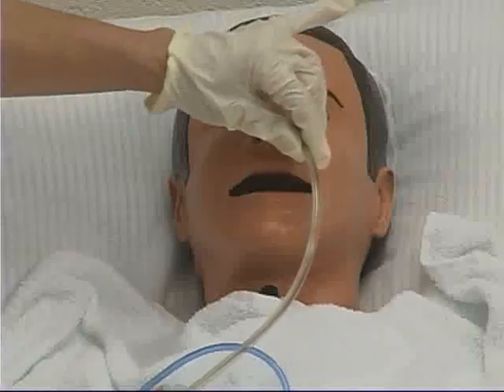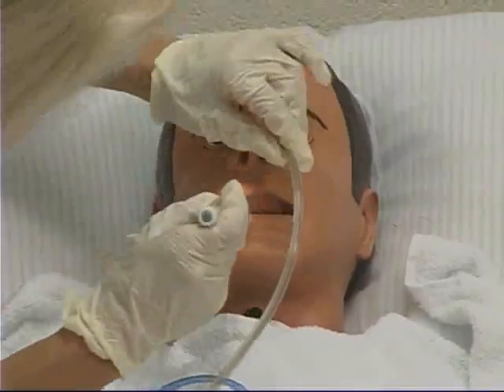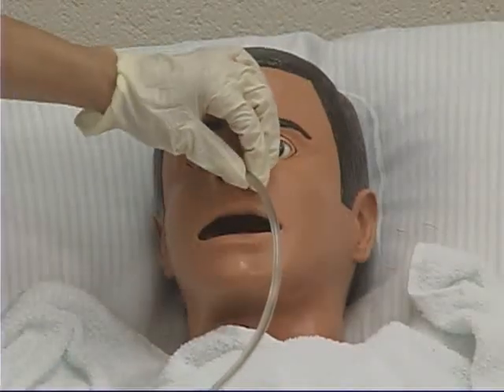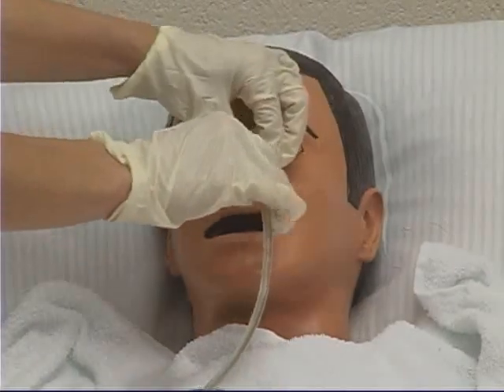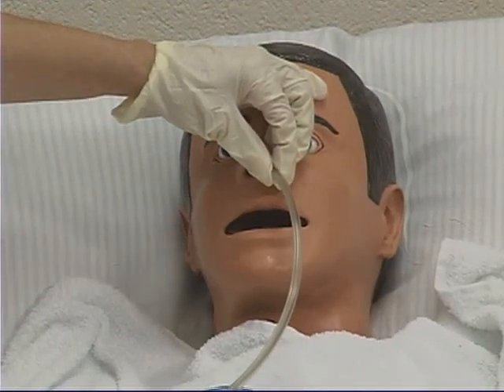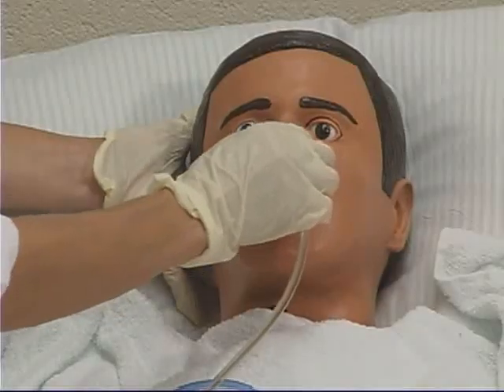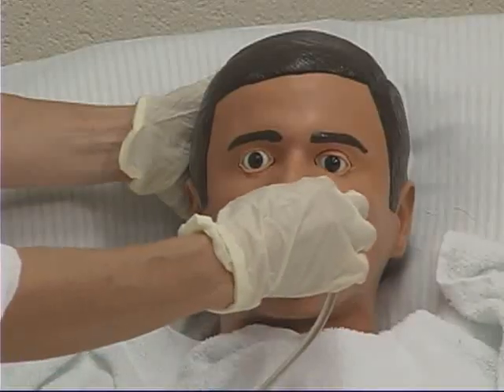Turning and directing the tube helps it conform to the anatomic passageways. When the tube reaches the nasopharynx, resistance will be felt. Have the client open their mouth and check with a pen light to visualize the tube, ensuring it is at the back of the throat and not coiled up inside the mouth. Ask the client to take a sip of water several times while advancing the tube until the tape mark is reached.